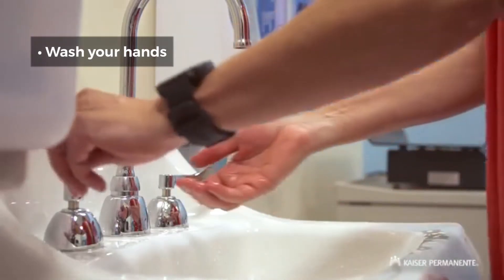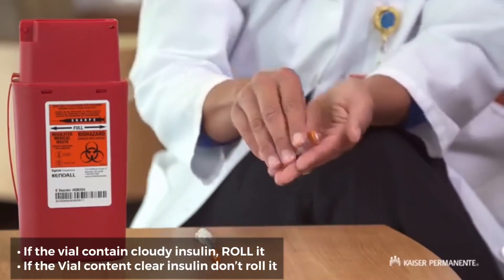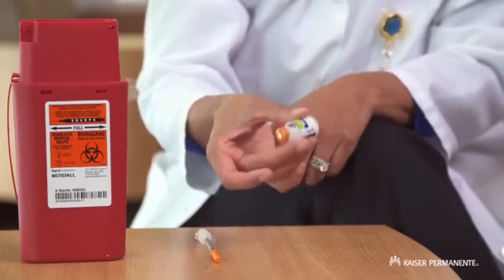Always wash your hands with soap and water before you begin. If you have cloudy insulin, it needs to be mixed. Gently roll the bottle in your hands, then rotate it from top to bottom without shaking.